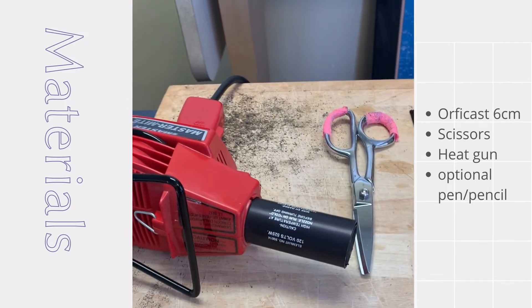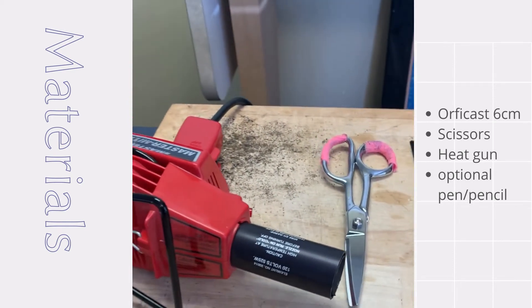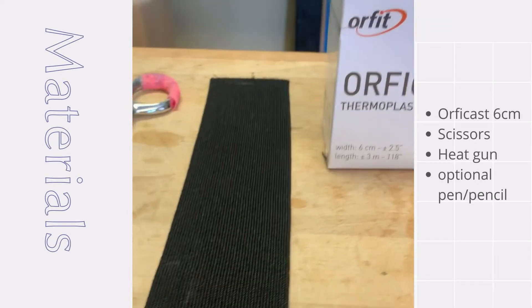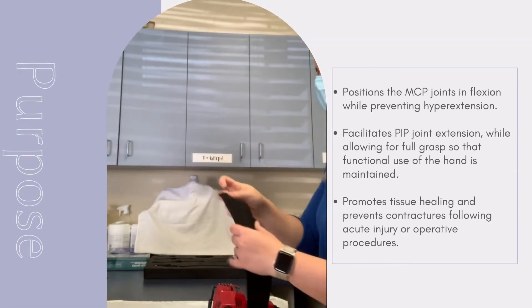The tools needed to fabricate this orthosis include Orficast, which here we're using the 6 cm width. We're also going to need scissors and a method to apply heat to the material. Alternatively, you could use a thermoplastic material, and you may also opt to have a marker or pen handy so that you can mark off any places that will need to be trimmed later on.